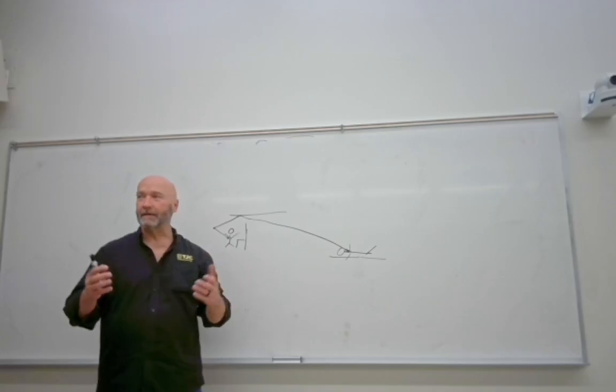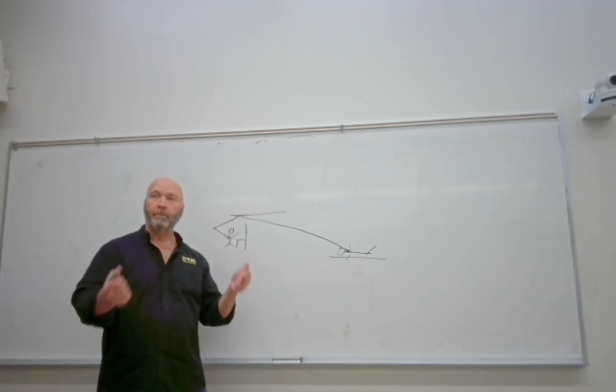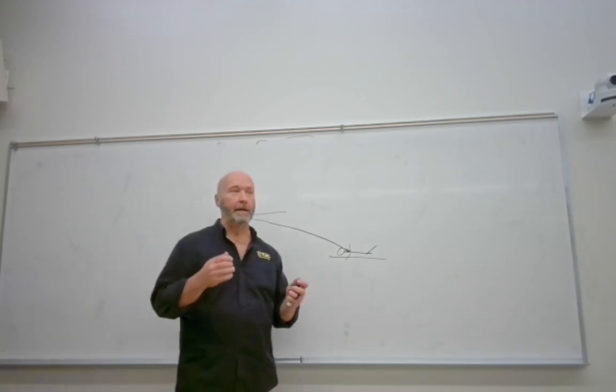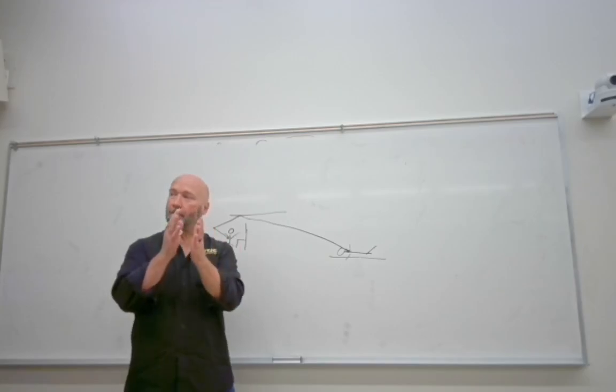But in that same set of experiments, I'd take films and put the film on the table, and then I'd take the X-ray beam and point it in all different directions to see how much leakage radiation, which we'll talk about. Leakage radiation is coming out of the protective housing. Protective housing should stop X-rays except for what's coming through the port.